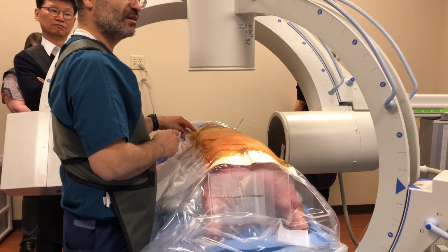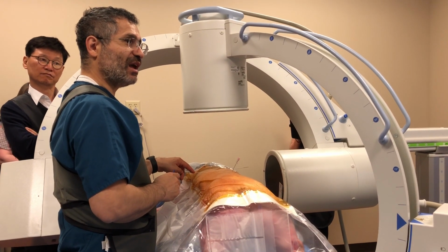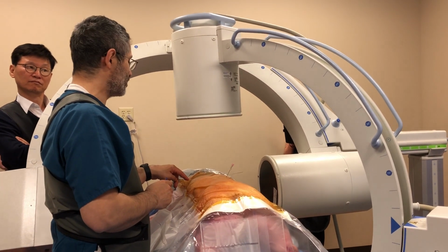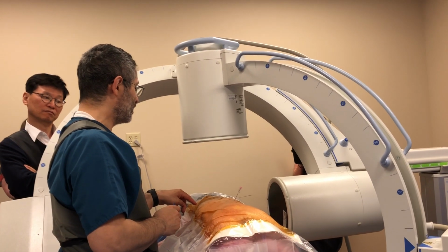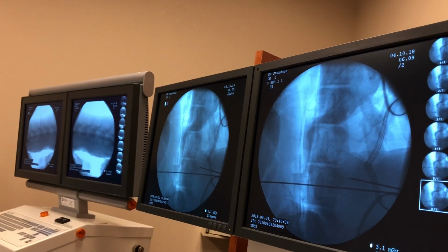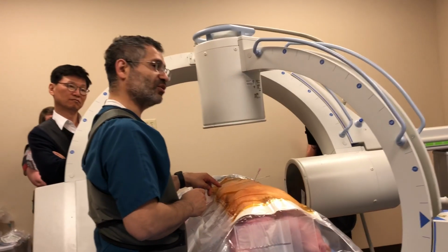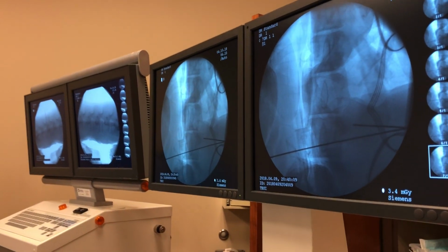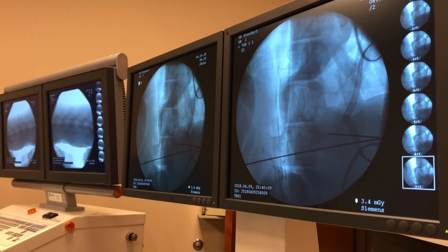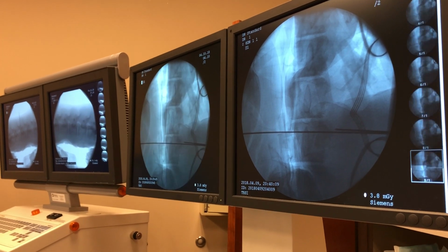So, what I mean, I mark the trajectory, that's the trajectory. But, get the X-ray. Even if I'm far away from that, but I'm parallel, this is not good, X-ray. Because I'm not parallel to that. This is X-ray. Good enough. I'm obviously a little extreme right now.